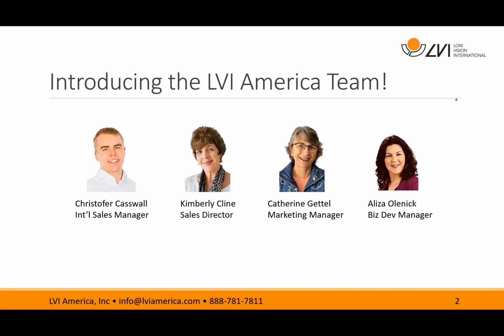Since there are a couple brand new people, I'm just going to say that we are LVI America. LVI is headquartered in Sweden. That's where all of our products are developed. They're built. They're actually manufactured and put together by hand. And this is where we've been making low vision products for over 43 years over in Europe. So we're thrilled to be joining you today, showing you our tab product.